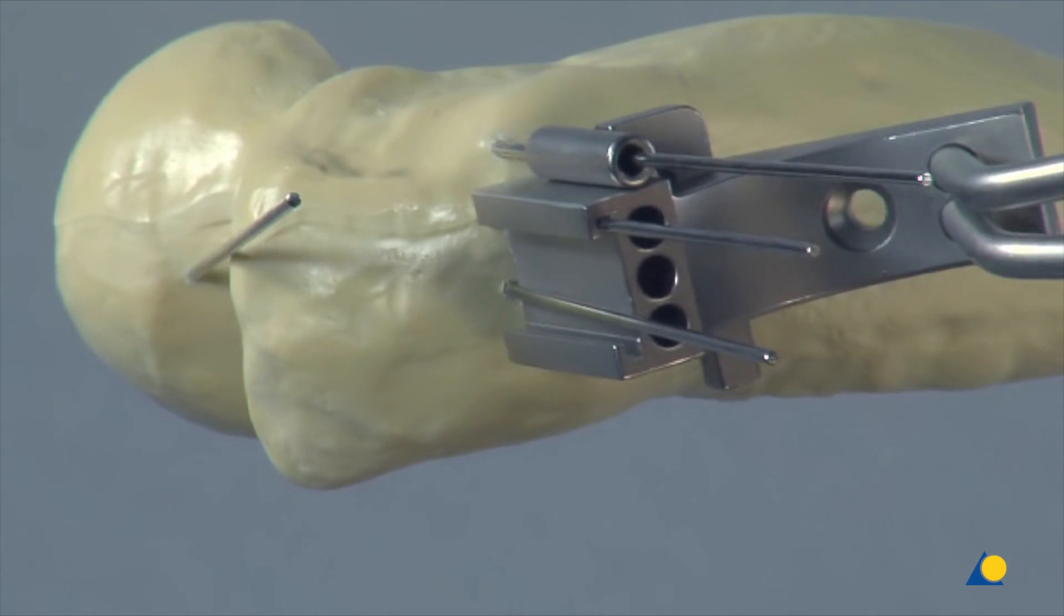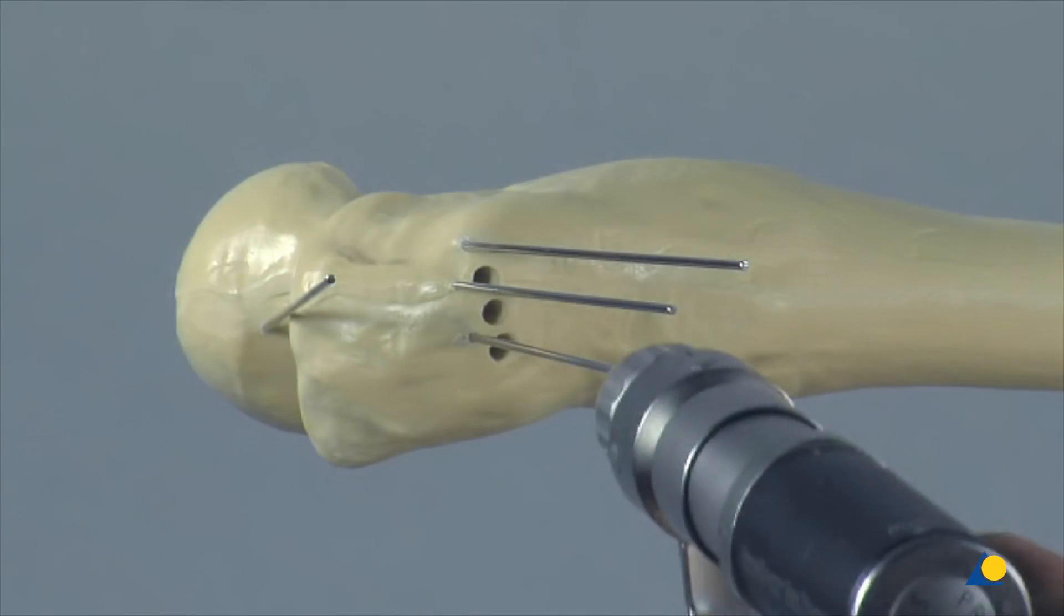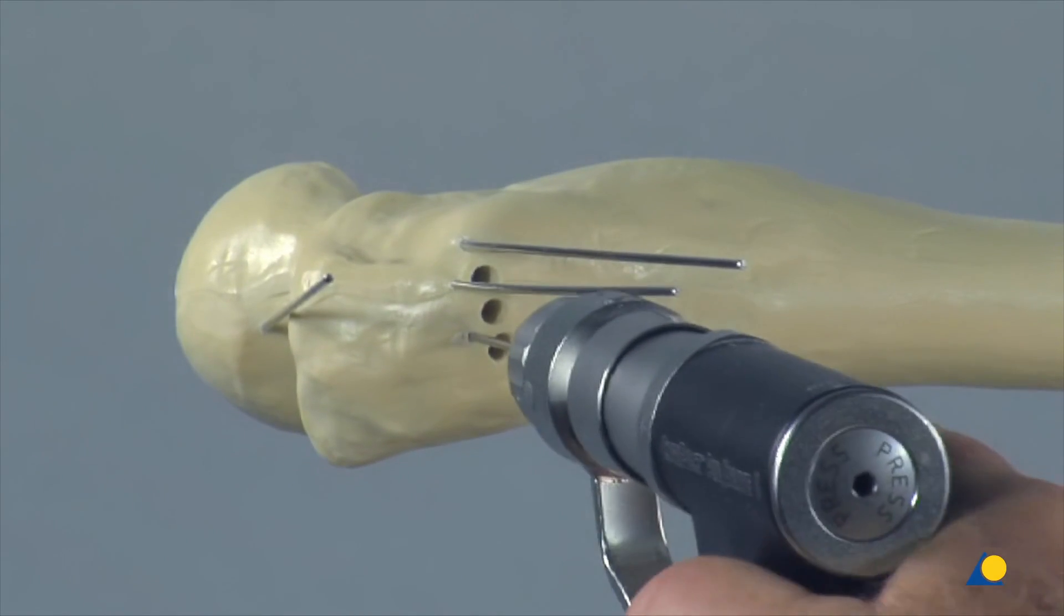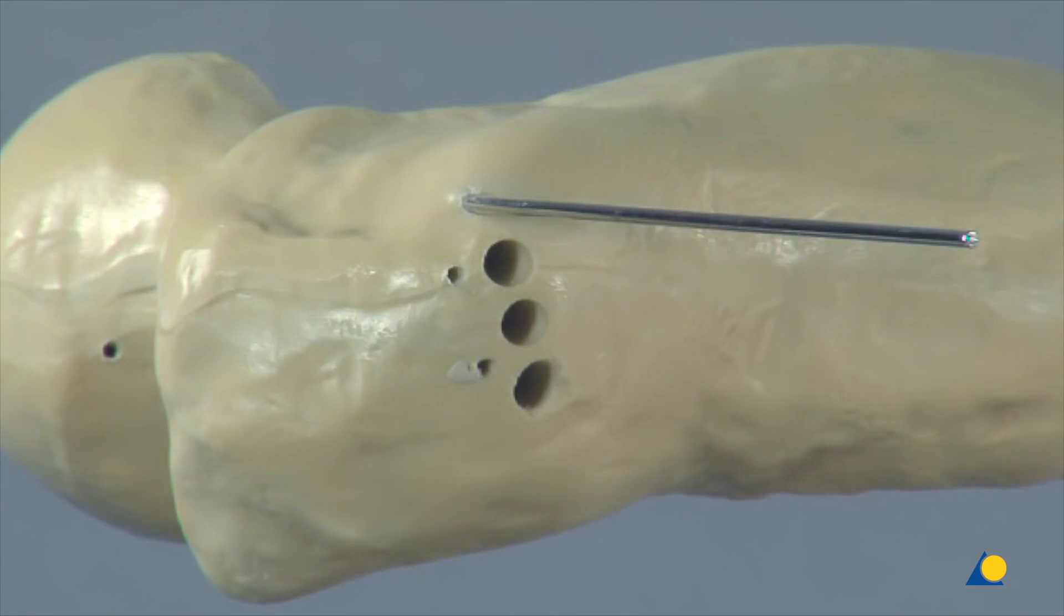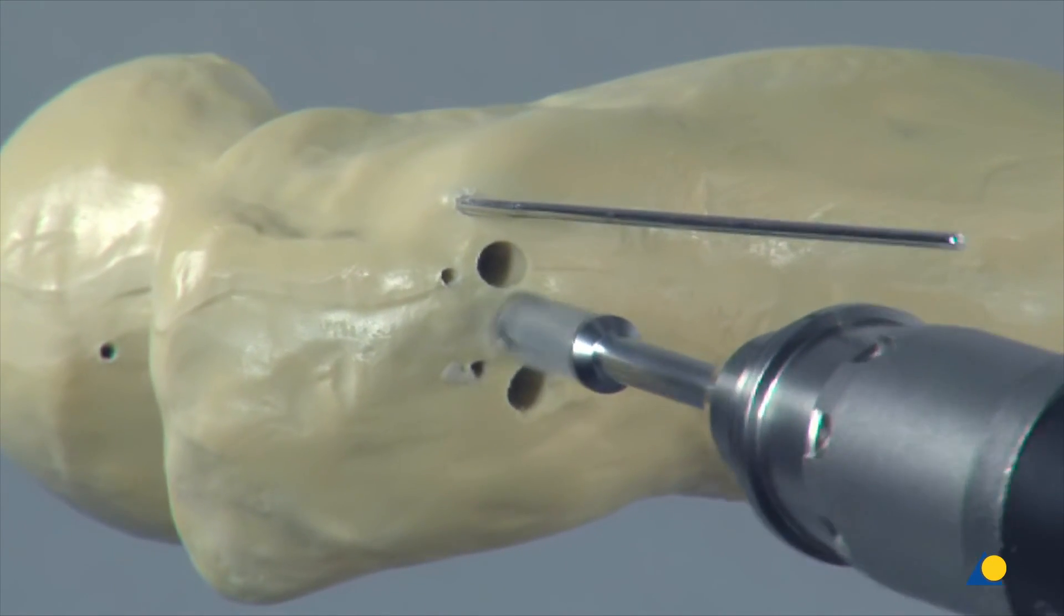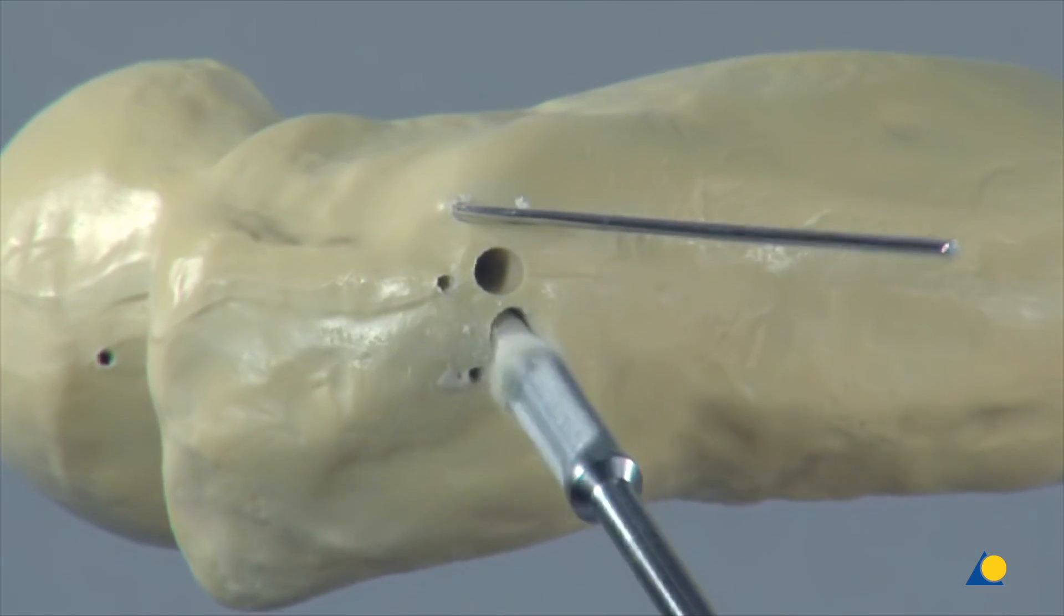The triple drill guide and the first three K-wires are now removed. The drill holes are enlarged with the router to create the opening for the seating chisel.